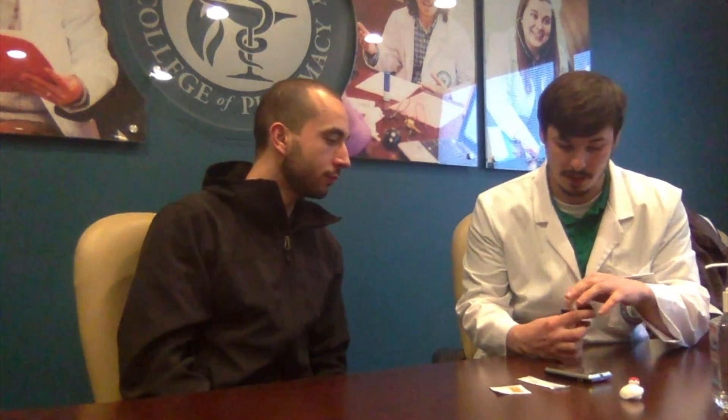I'm just going to start by walking through each individual component. So this is the glucometer — this is what's actually going to take and measure your blood glucose levels. Inside this container we have multiple test strips. The test strip actually goes into the glucometer and takes your blood sample into the glucometer.